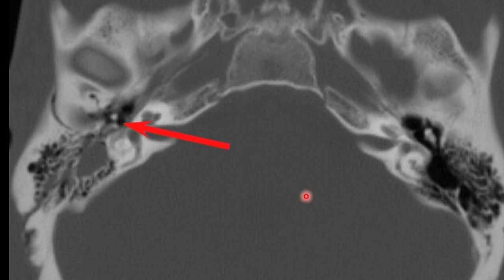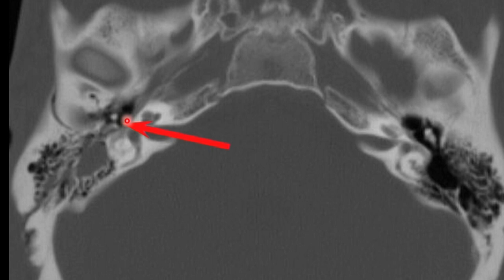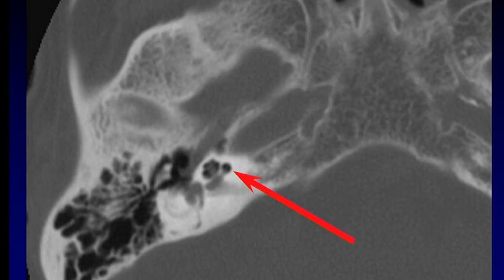Don't forget to look for ossicular dislocations in longitudinal fractures. This one is a nice obvious fracture where the ice cream is a millimeter or two off the cone. They're often much more subtle than this — just slight asymmetry, slight widening of the malleoincudal joint on one side or another. But I've shown you one that is a more clear case of ossicular disruption.